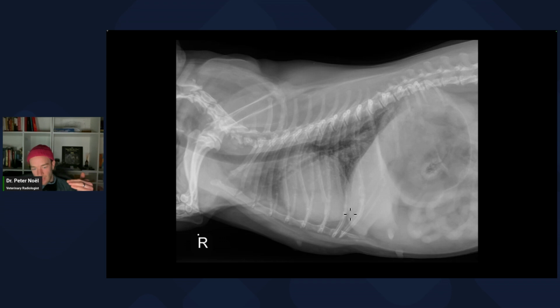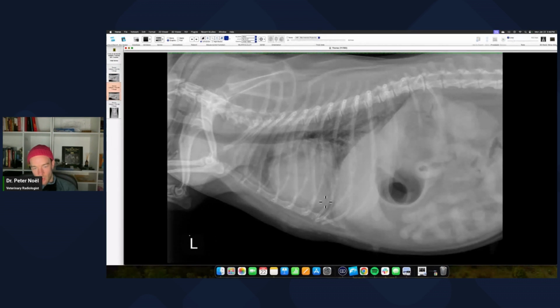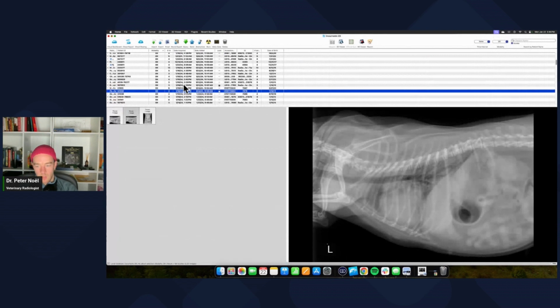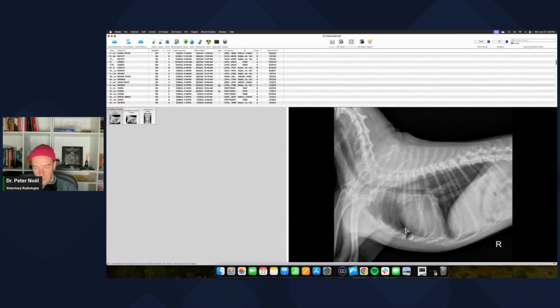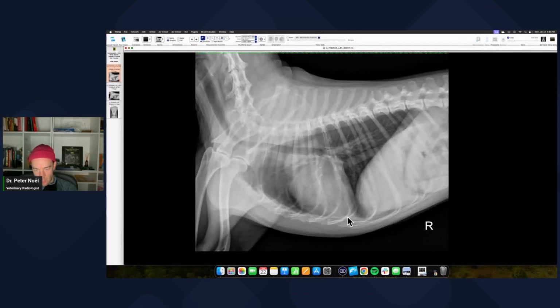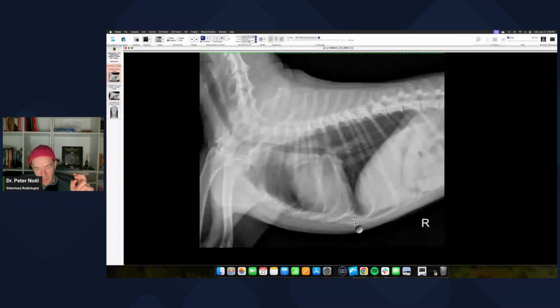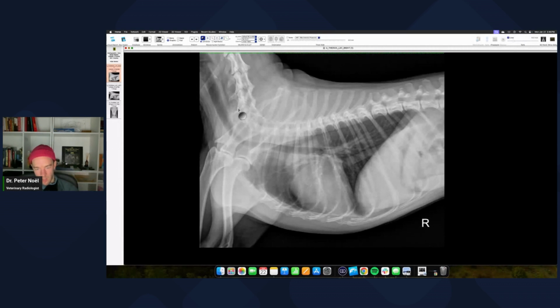But this cardiac apex normally should stick on the sternum on a right lateral view, okay? On the left lateral view, the cardiac silhouette apex normally is rotated dorsal from the sternum. So when you see that dorsal rotation on the left lateral view, that's fine. I think I saved this one because if you see this right lateral view on this normal cardiac silhouette, this thing is down here, okay? This left lateral view, see how it's rotated away? So you can't really see it. It's because it's sort of tipped away. And this one you can kind of see. It's a little bit more flat.